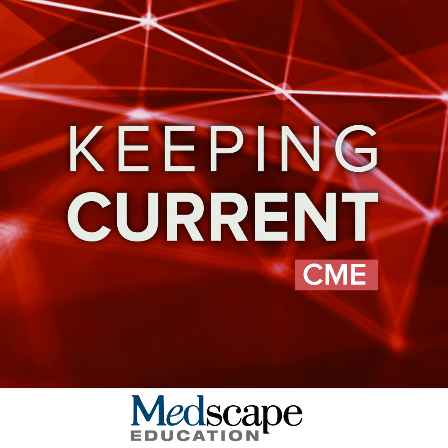So when is it not appropriate to get an amyloid and a tau PET? I think this is also really helpful to walk through. Somebody that is not cognitively impaired, so someone with normal cognition, they are not eligible for these therapies, and so these scans are not appropriate to use.